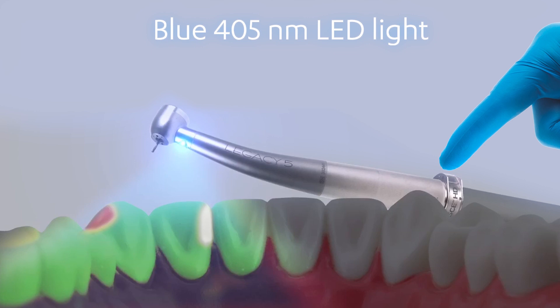The map reveals the difference between decay, composite material and healthy tooth. Porphyrins inside caries cause bacteria to fluoresce orange or red, while healthy tooth glows green.